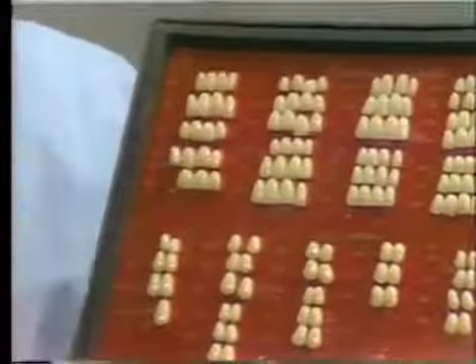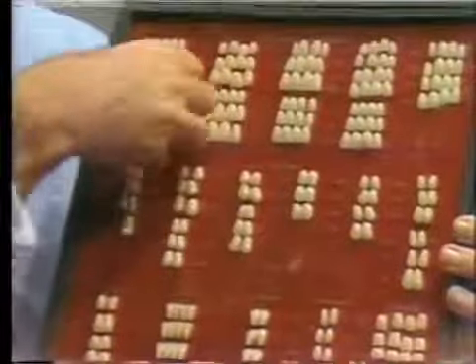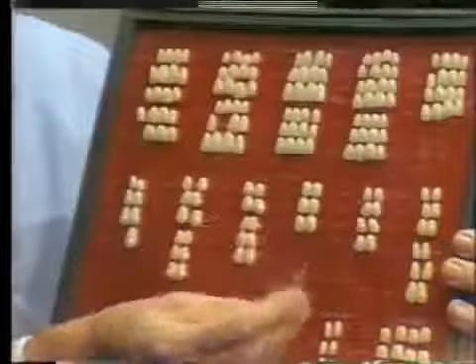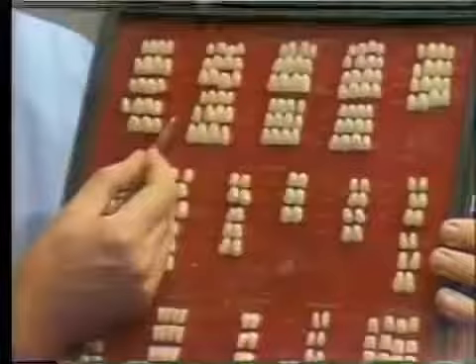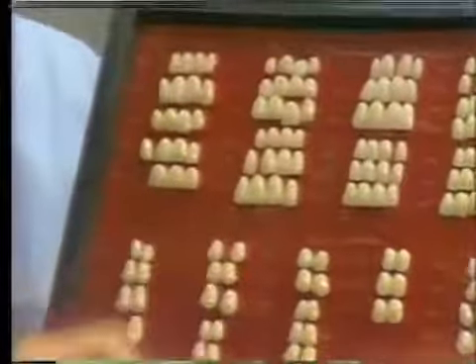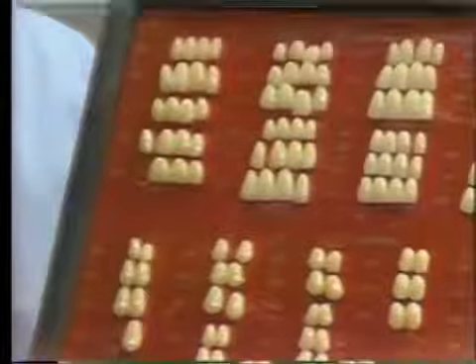So you can pick one of these out of here and take it over to your study cast and try it in position in there and see if it's correct. If it's not, you can put it back again in here and maybe select the next size larger and try this in position and see how that is for that particular case. Once the mold which is required is selected, then all that you do is to note the index number along the side here. So in this way you get a shade number and a mold number, and with those two you can go to the supply house or the dispensary and ask for that tooth by the shade number and the mold guide.